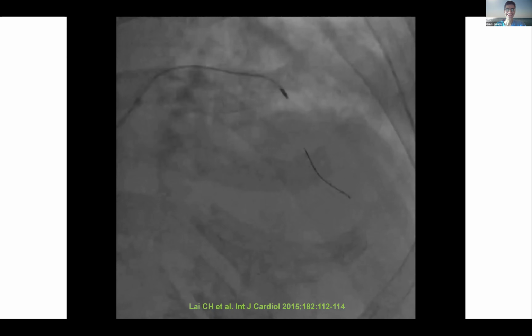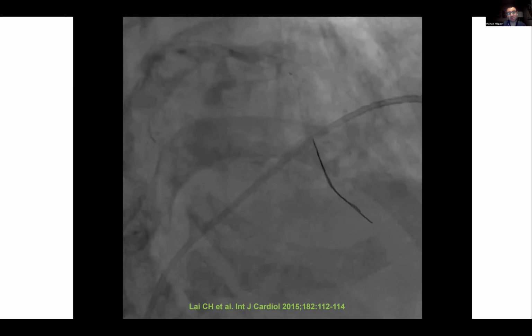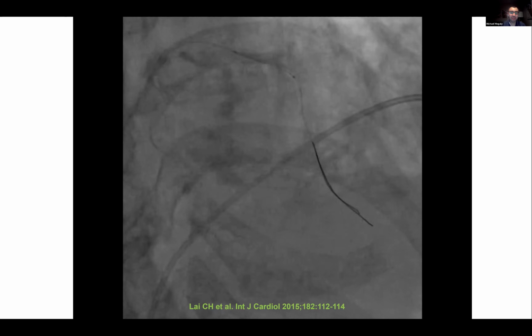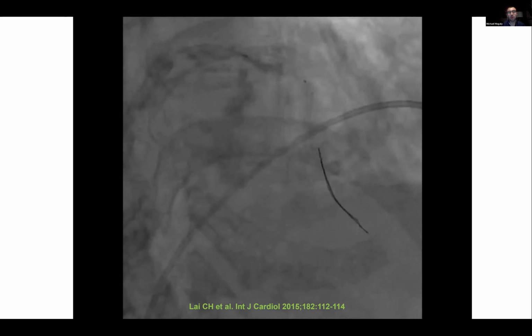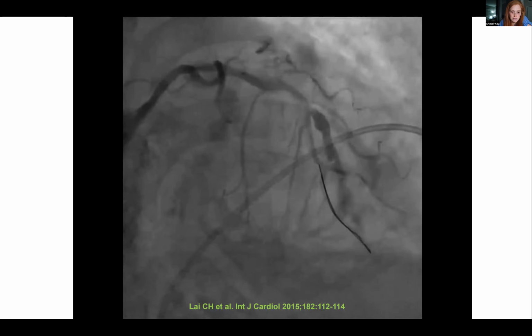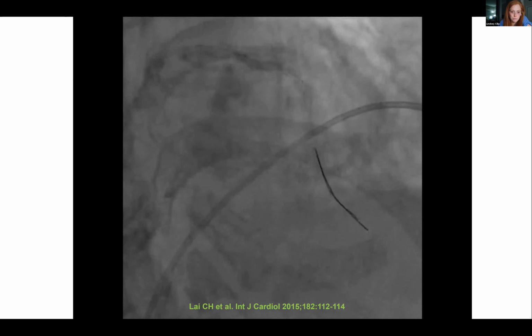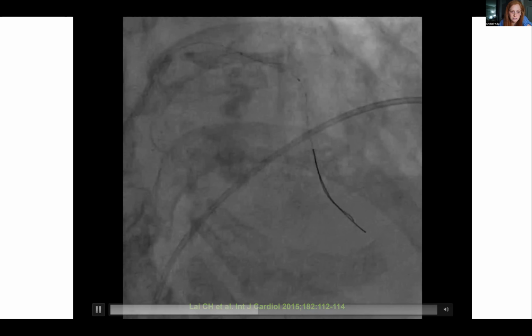Number one. That would be... But although I'm not sure if the wire would be king, you exchange it and then balloon right away, right? Wow. Yeah. It's quite a... quickly to get your covered stent, or if you don't have the covered stent in the room, get any balloon you've used prior, provide tamponade until you can get the covered stent in the room, and then just deliver the covered stent as quickly as you can.